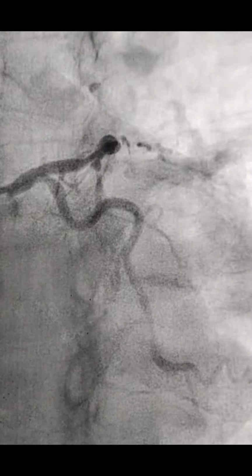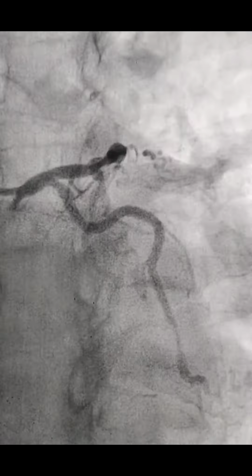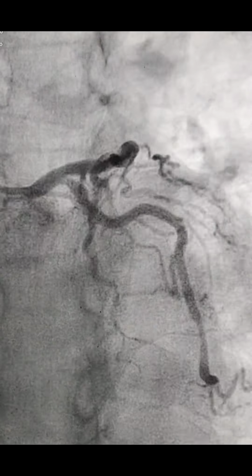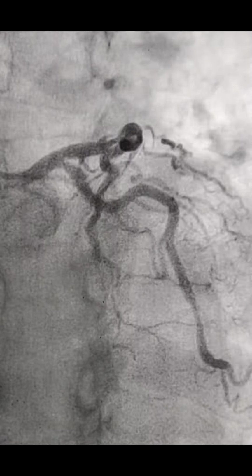And this is a right caudal view, and you can see there is, in the LAD right from proximal, a significant, chronic lesion, and I can see the distal LCX also has a significant lesion, and the ostial LCX also has a significant lesion.